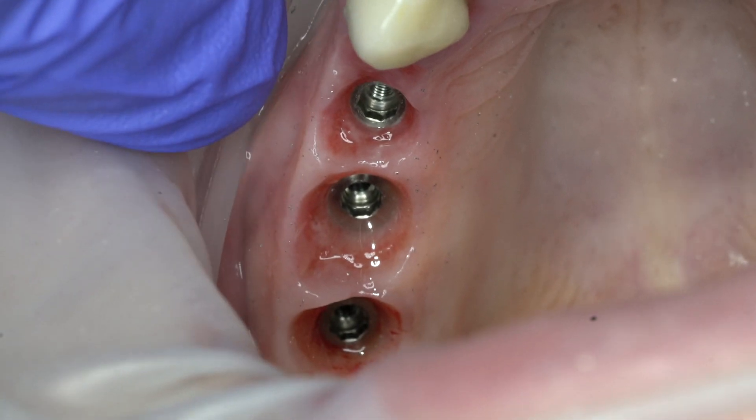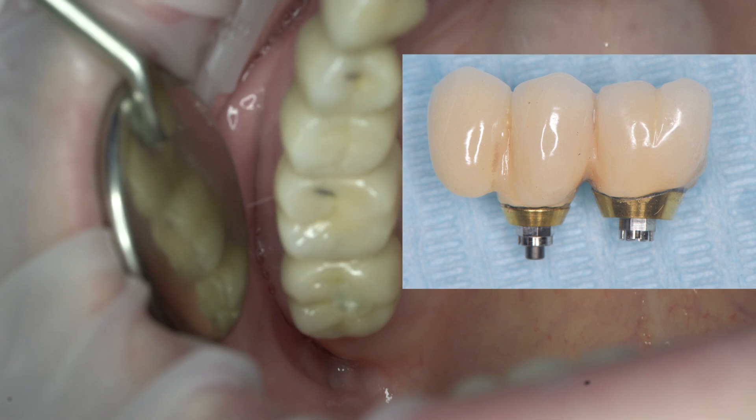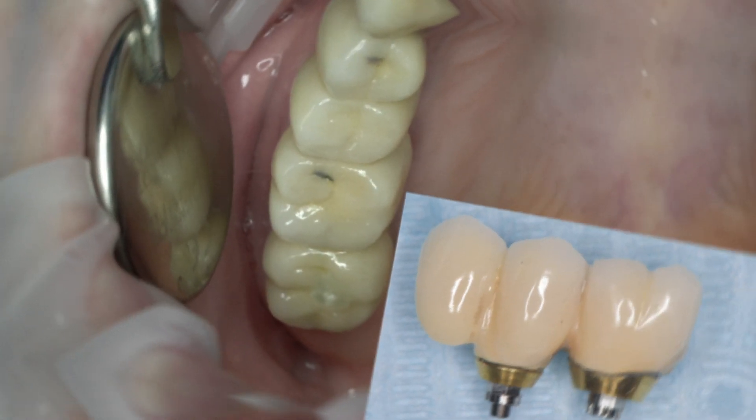Hi, and today we discuss how to remove a cement-fixed crown from an implant. Knocking down the restoration is fraught with fracture of the implant body, especially if the crown is fixed with permanent cement.